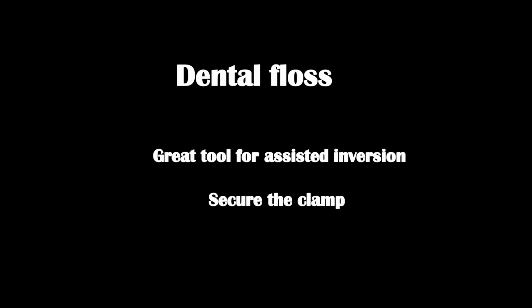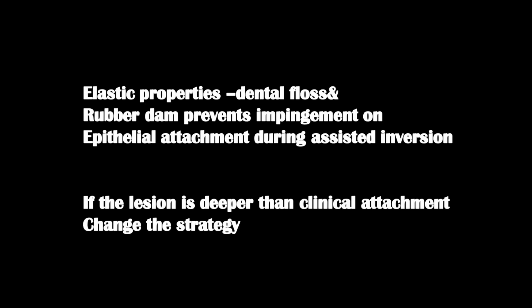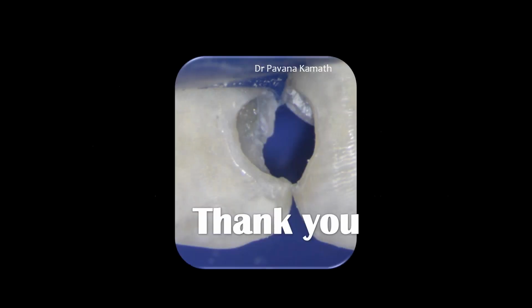to the soft tissues. Elastic properties present both in the rubber dam and the dental floss prevent impingement on the epithelial attachment during assisted inversion. If the lesion is deeper than the clinical attachment, then of course we have to change the strategy and management of that case. So thank you for your kind attention. We will now move towards the demonstration.